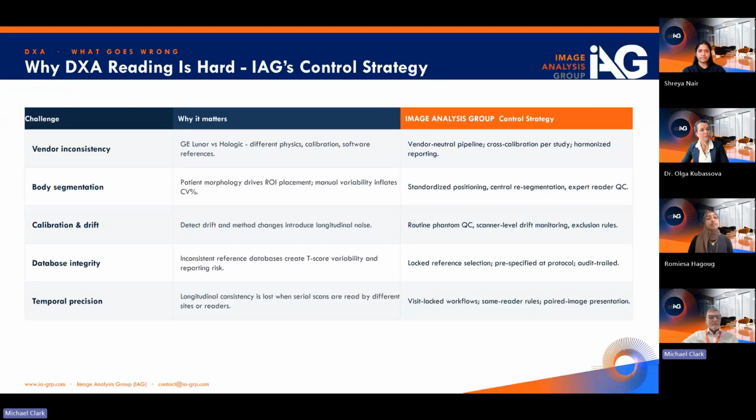And then obviously we're constantly looking for calibration or drift throughout the trial. So we ask the site to upload their instrument quality control data, and we see over time if there are issues or drift in their scanner performance, and we can provide that detail to the site and help them manage that situation. We also have processes for if a machine changes. Obviously, we don't want that. That could have an effect on the patient data for that site, but we do have a process to manage that, to keep the consistency and provide the data outputs for the trial.